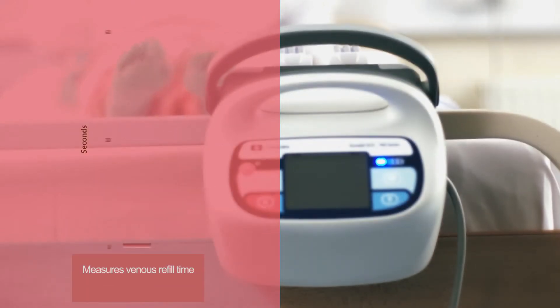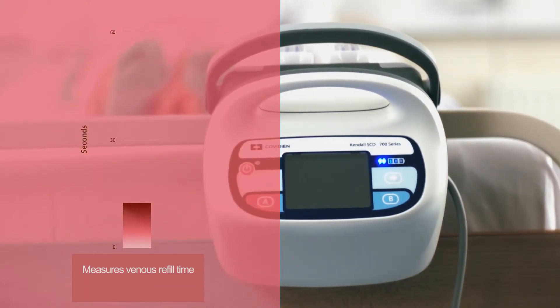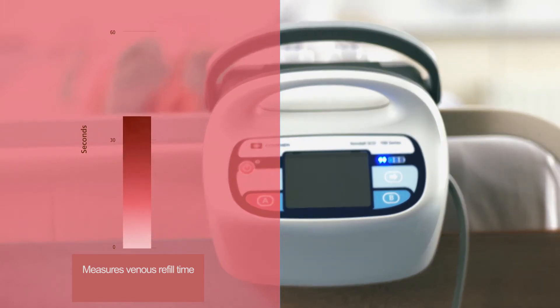VRD works by measuring the time it takes for a patient's veins to refill with blood after being compressed, and then setting the frequency of compression cycles on the patient's specific venous refill time, anywhere between 20 and 60 seconds.